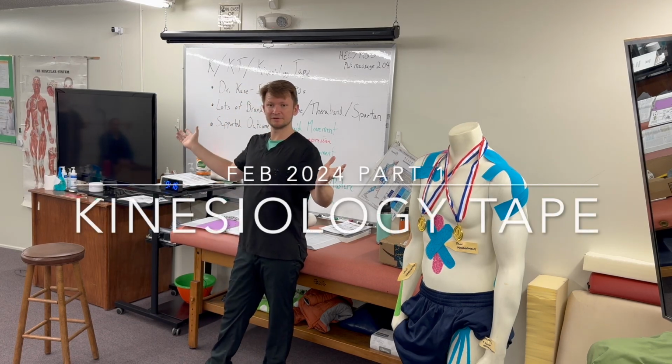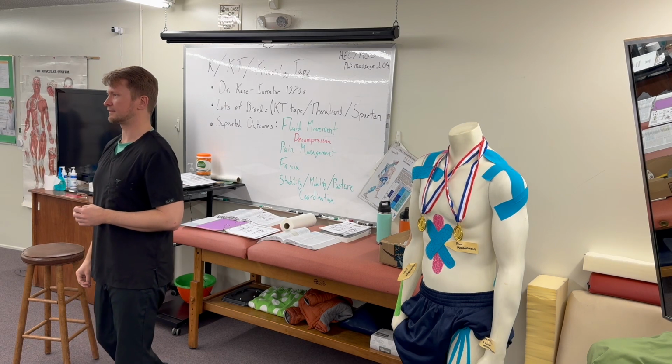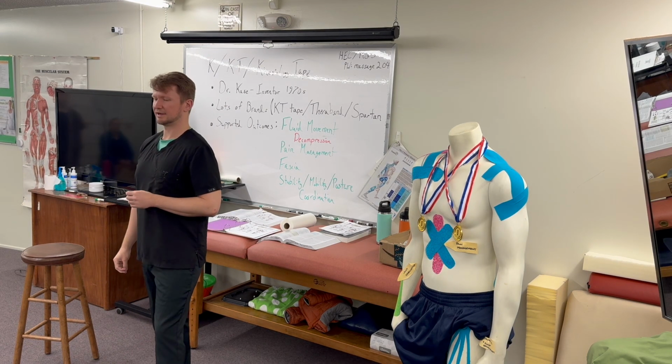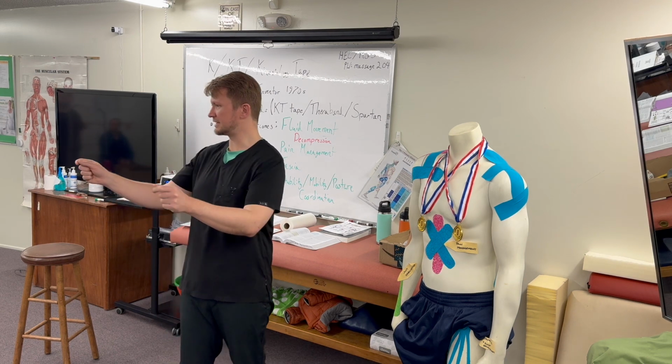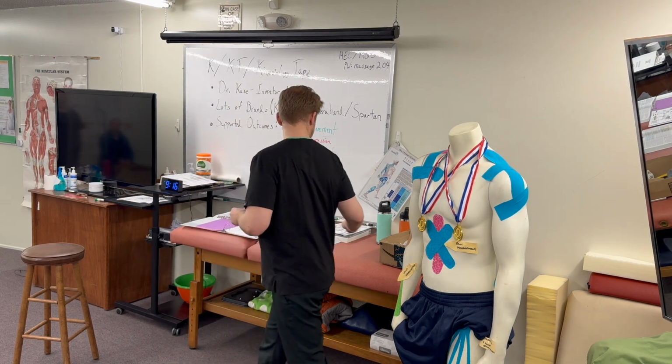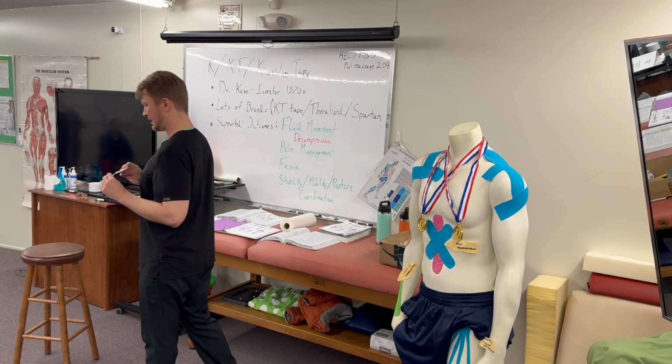K-tape, kinesio tape, the way I'm kind of always thinking about it more is therapeutic taping. It's stretchy elastic tape, and did everybody get the box? So go ahead and unpack those. We'll start with looking at this stuff.